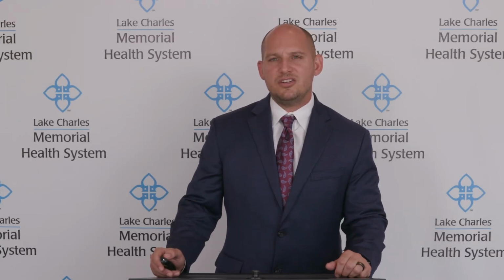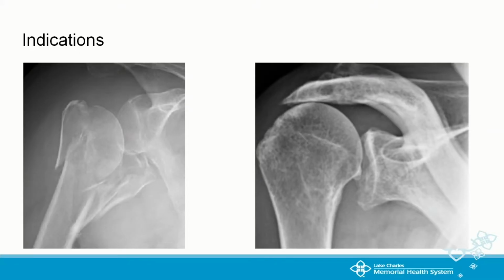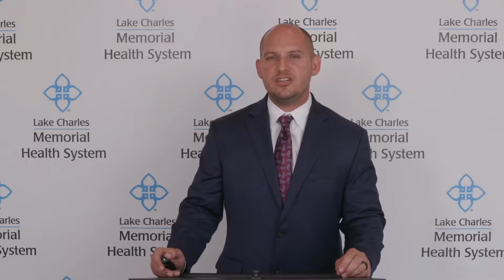We also have indications when we do fractures, like we were talking about Dr. Neer and his original way of putting these in. When you get really bad fractures, like you see on the left here, this is a proximal humerus fracture. There are multiple pieces here. These are really difficult cases, and sometimes we take a patient's age into consideration, their bone quality, and how many fractures. Putting in a new shoulder may be a good surgery for that patient.